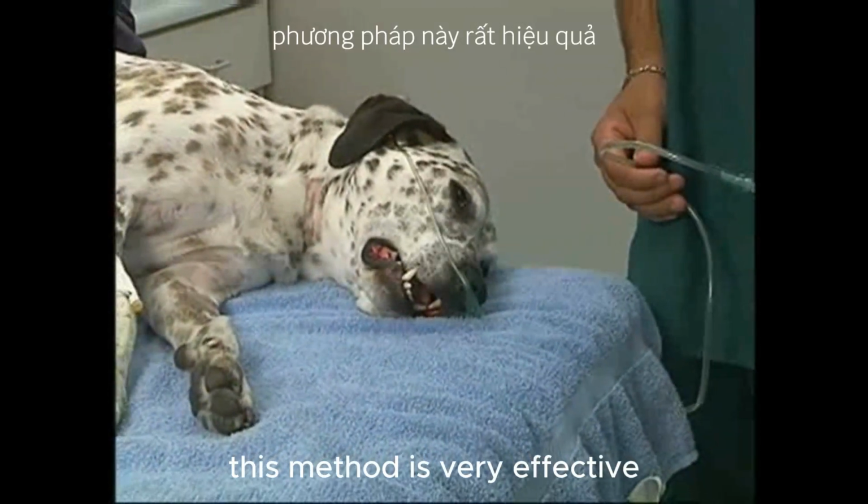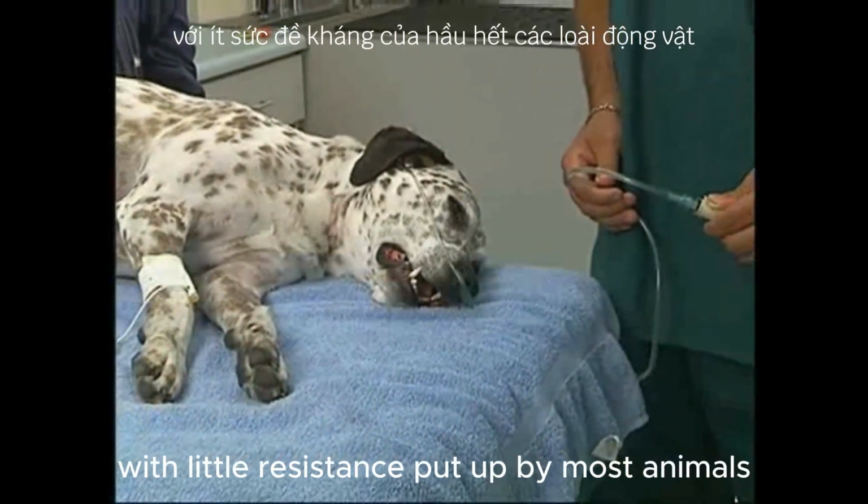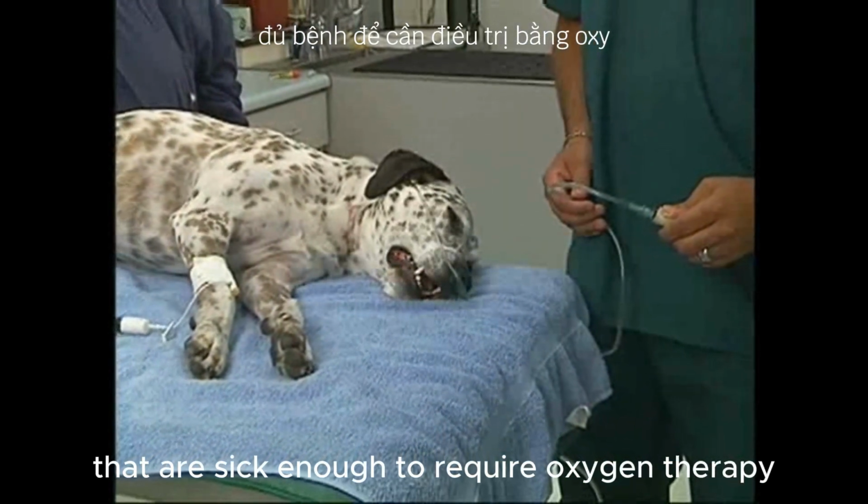This method is very effective with little resistance put up by most animals that are sick enough to require oxygen therapy.